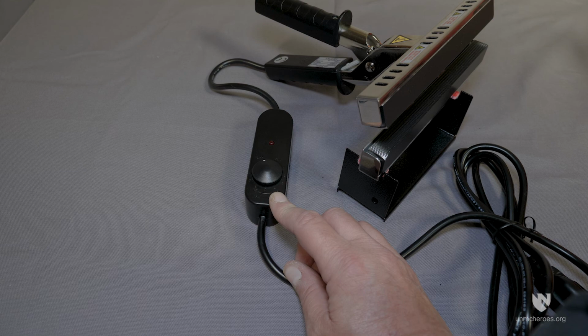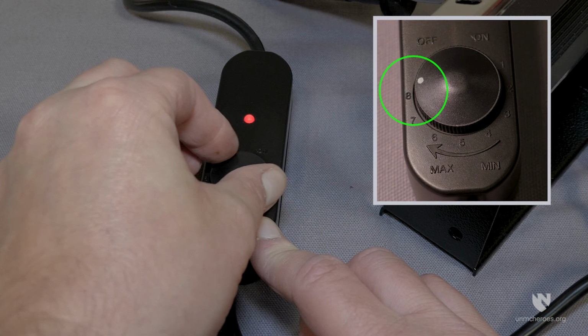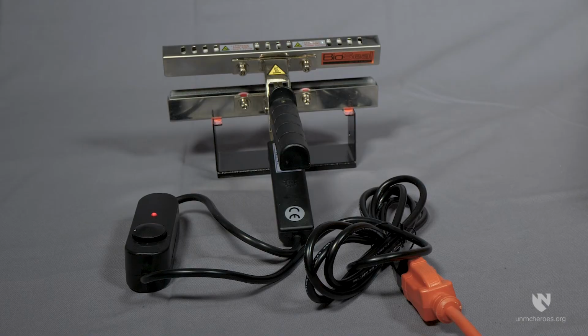Place the thermosealer into its stand and set it to the highest setting. To properly weld the material together, the thermosealer should be used at its highest setting, level 8. Within 10 minutes, the thermosealer will have reached operating temperature and the system is ready for use.